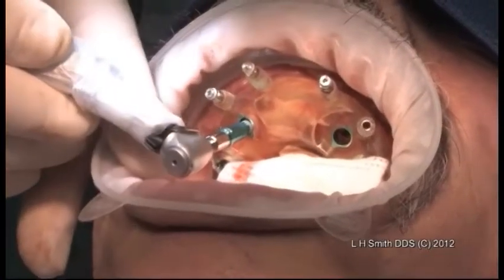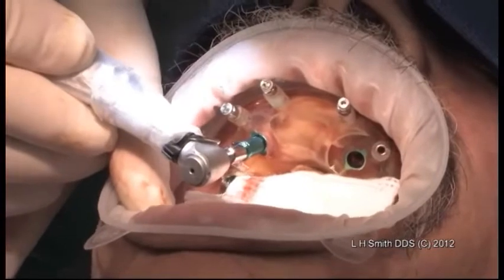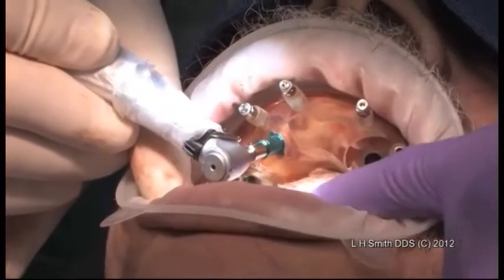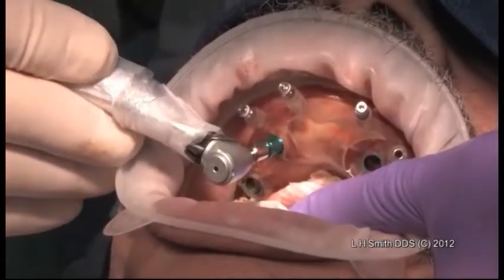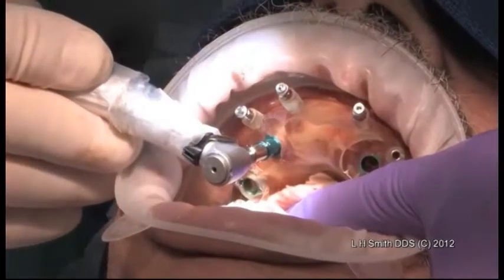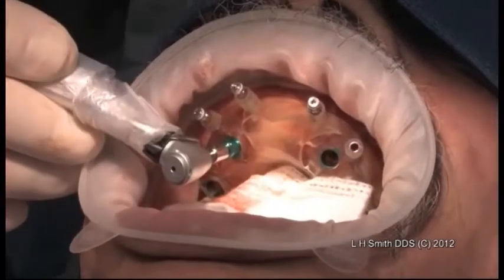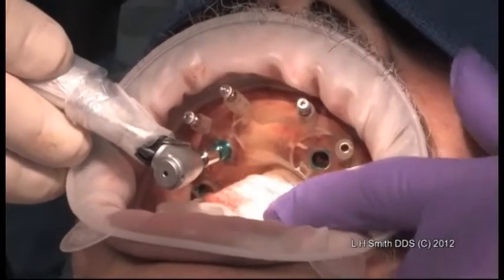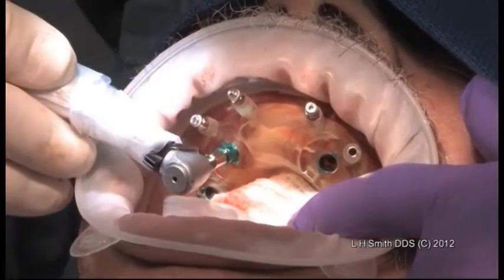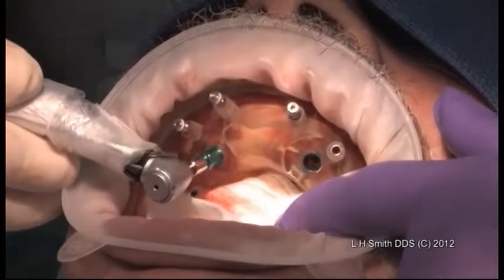This is going to be guided into the sleeve, and we're just going to let it take its time. I start with 30, depending on how far it gets. That's as far as it got with 30. I'm going to reverse this, and we're going to bring that out.